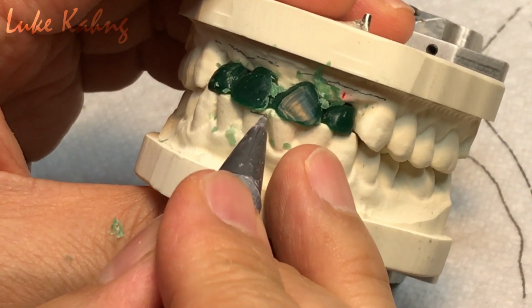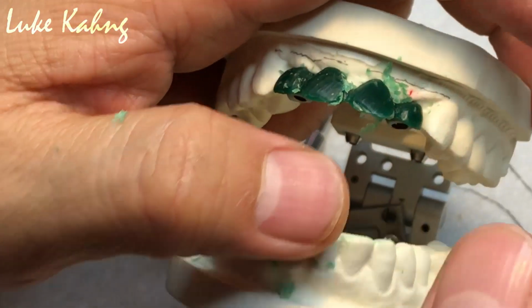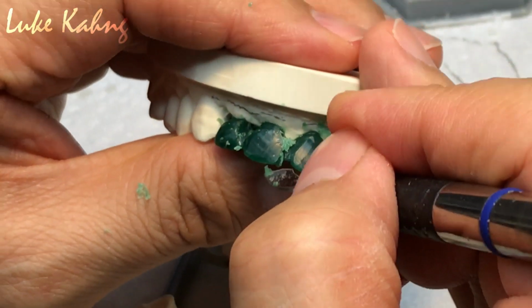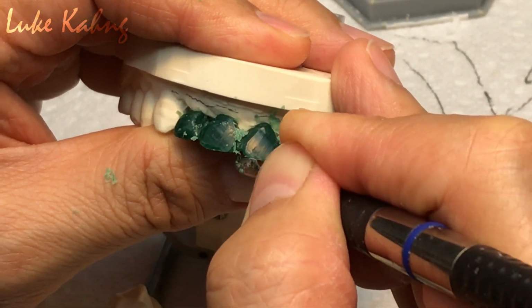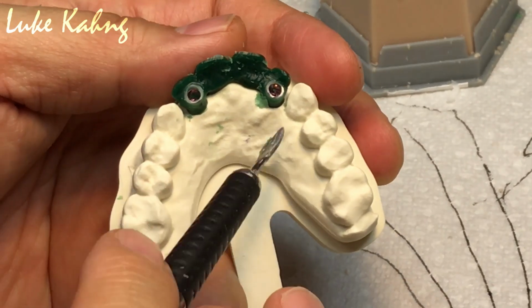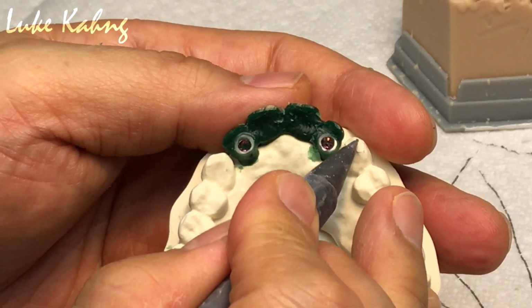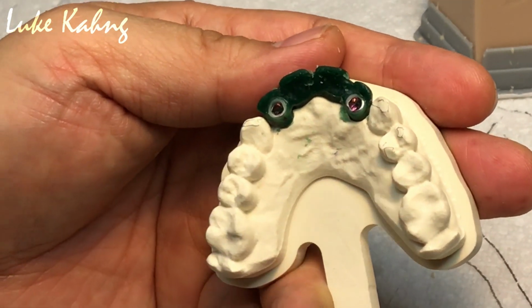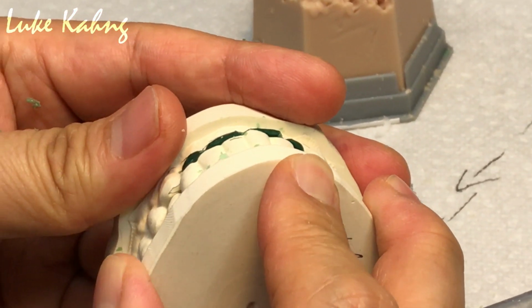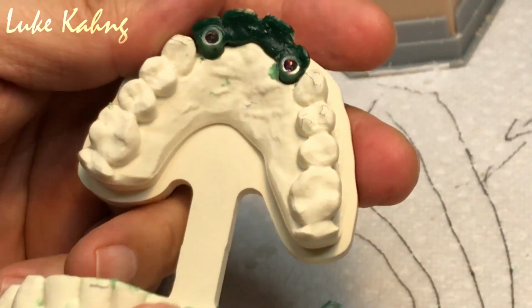And a little bit tricky part. Here will be final. That's final, too long, so I cut it, just a little bit. That one. So, you see the grind pattern? You see it's ground, meaning zigzagging, go over, right? Like that.